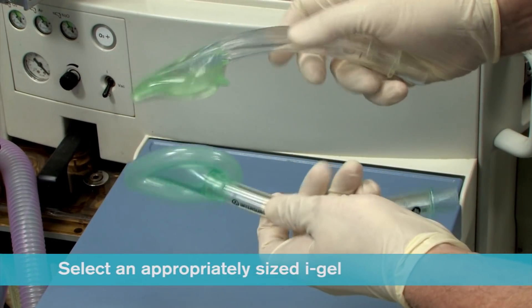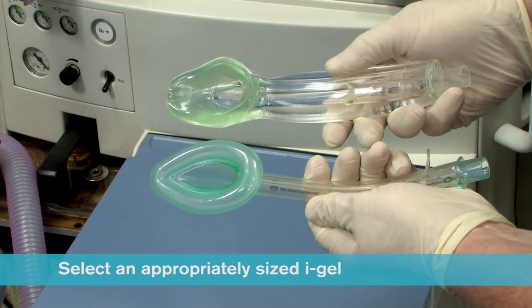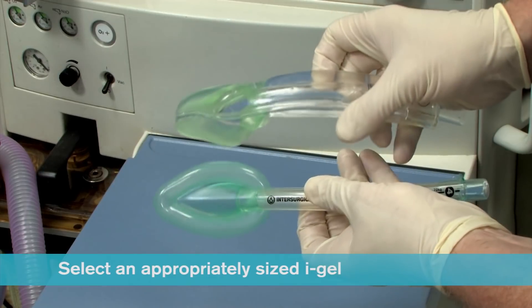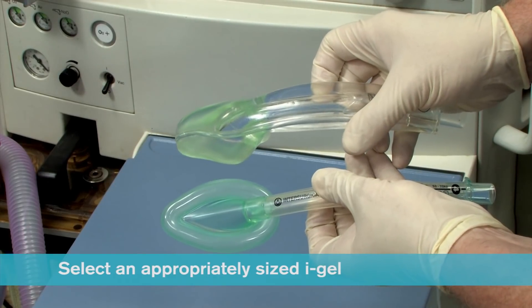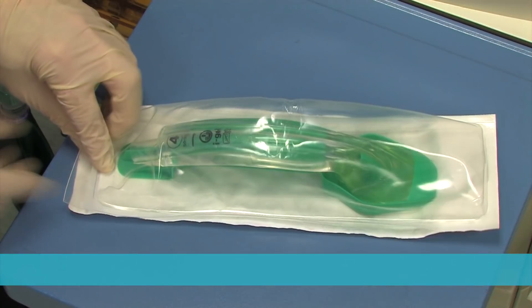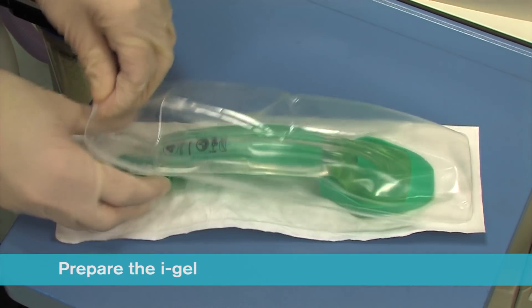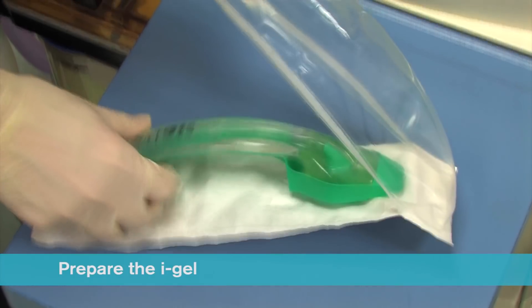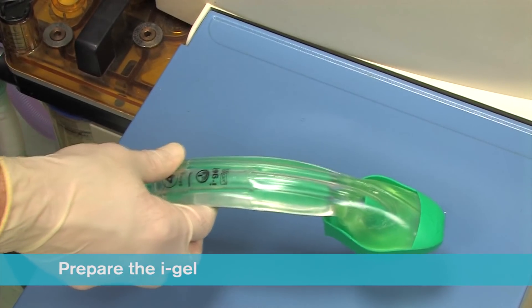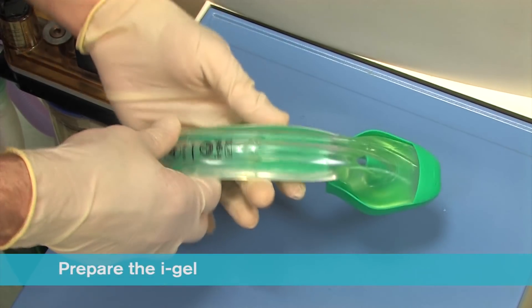When selecting size, it should be remembered that the iGel cuff does look smaller than the corresponding size of many traditional supraglottic airways with an inflatable cuff. Ensuring that you conform to local policy for hygiene, open the iGel package and on a flat surface take out the protective cradle or cage pack containing the device.